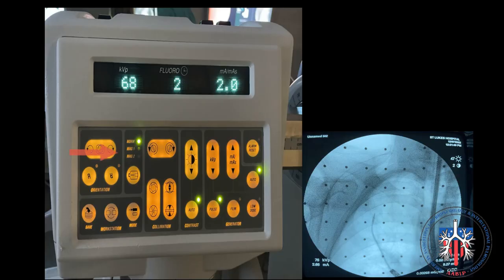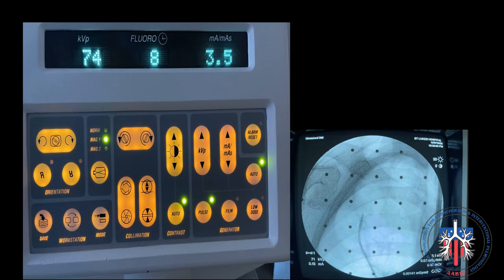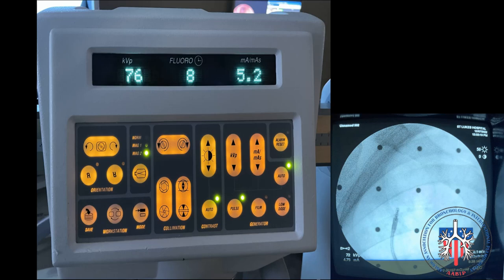Here is a non-magnified C-arm image. Here, the image is magnified times 1. Here, the image is magnified times 2.